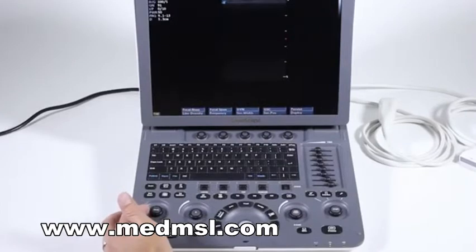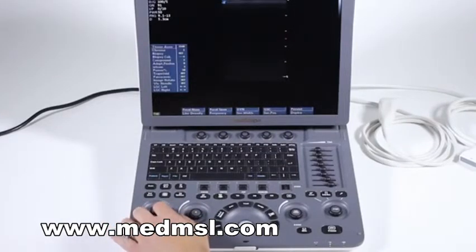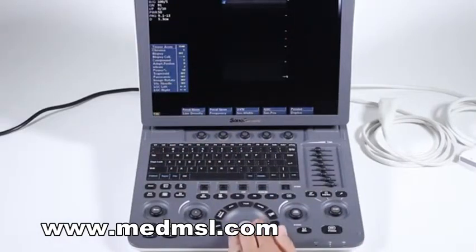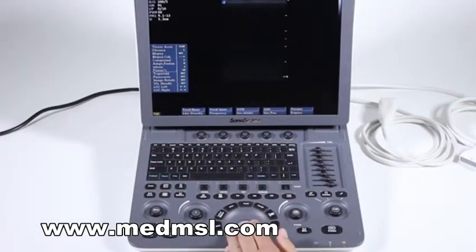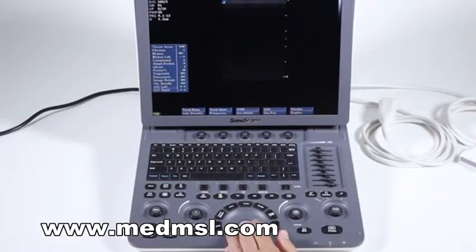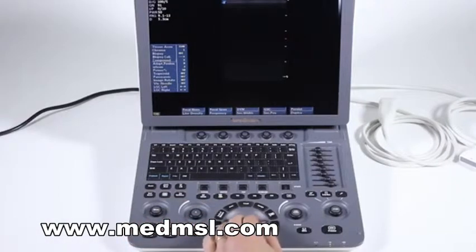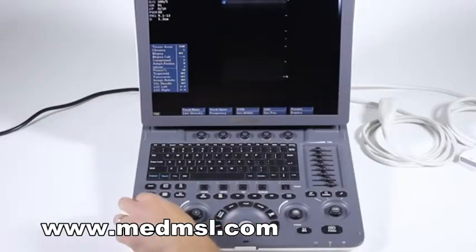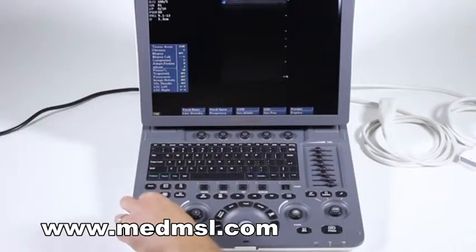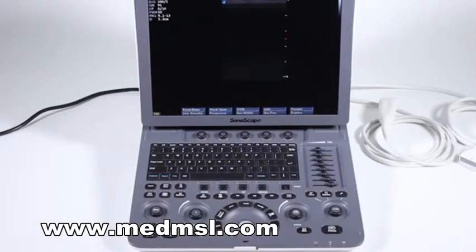Down along here we have our menu button. This is where you get to some of the system settings, or it will take you into further settings for optimizing your image, such as panoramic, trapezoidal imaging, compound imaging, and other adjustments to your screen. You would select an option and then twist this knob. Uscan, which I'm adjusting right now, is the speckle reduction technology. Press the menu button again to get rid of that menu.